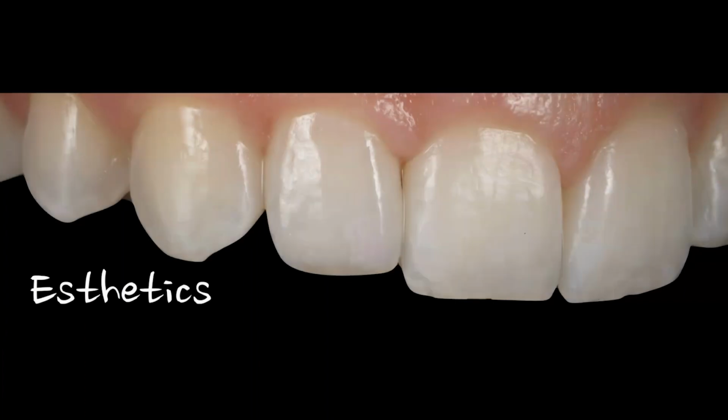Now look, I'm being super picky, right? Is that a big deal? When you see it in the mouth with saliva and the patient smiles, it's a home run. Everything is fine. But from a learning perspective, these are the little details that I want to harness, because we want to learn to make it harmonize the right way, not just because people see it from cocktail distance, standing 3-4 feet away from people. We want to make it harmonize when I can blow it up on a screen, and I show these cases sometimes on 20, 30-foot screens, right?